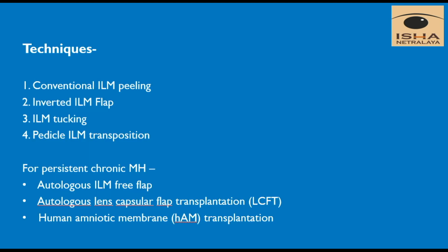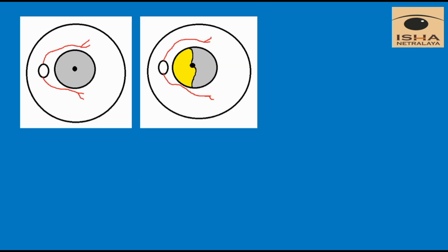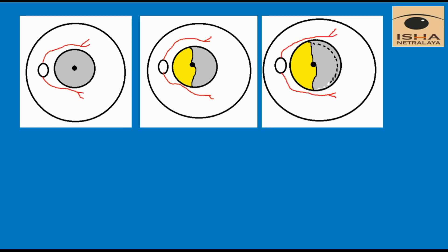These are the techniques used for macular hole closure, with conventional ILM peeling being the most commonly used one. In our technique, the ILM was stained, then the nasal ILM was peeled, following which a temporal flap was made and this flap was reposited over the macular hole.